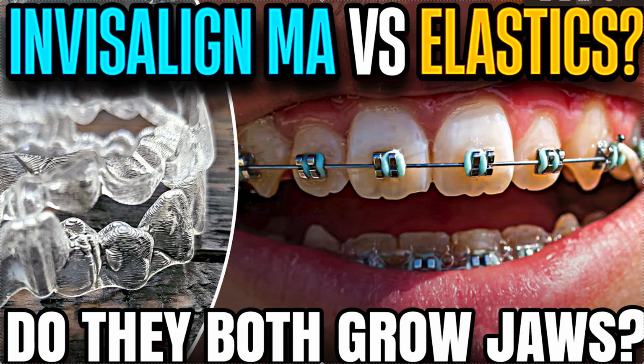Today we're going to go over the difference between how Invisalign with MA works, which is basically the same thing as a twin block, which is basically similar to a Bionator, versus rubber bands or elastics, and they work totally different. The mechanism of action is totally different.